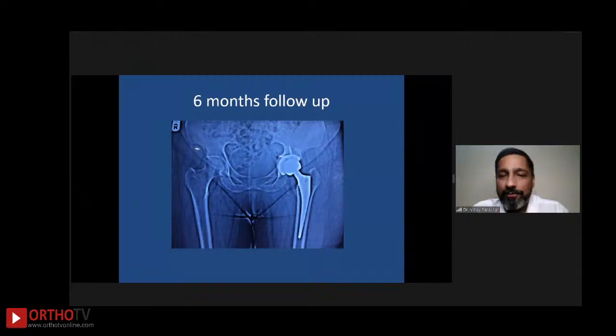So I would have definitely used, like the way sir just pointed out, a gription multi-hole, put in a lot of bone graft, because when you see discontinuity and it's not an acute injury, there's always some membrane behind there. So it's going to catch all your bone graft and then it builds up really nice.